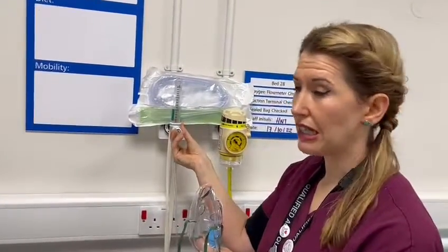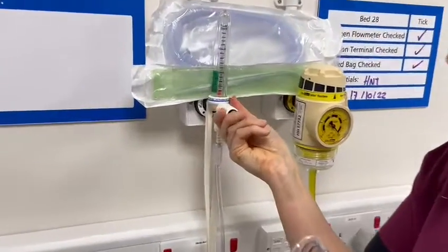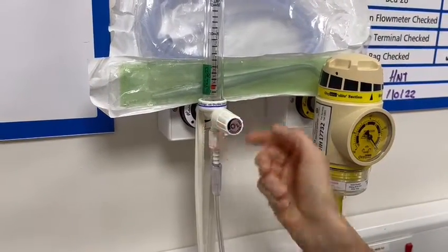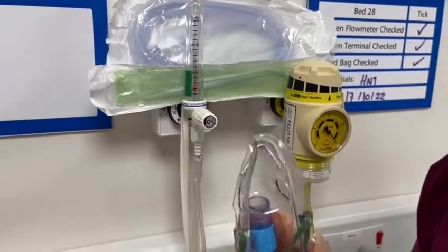I would then turn it up to two litres. Often people can get confused where two litres is — this is my one litre, and my two litres is where the ball sits with the black line in the middle of the ball. You can then hear the oxygen flow through that.